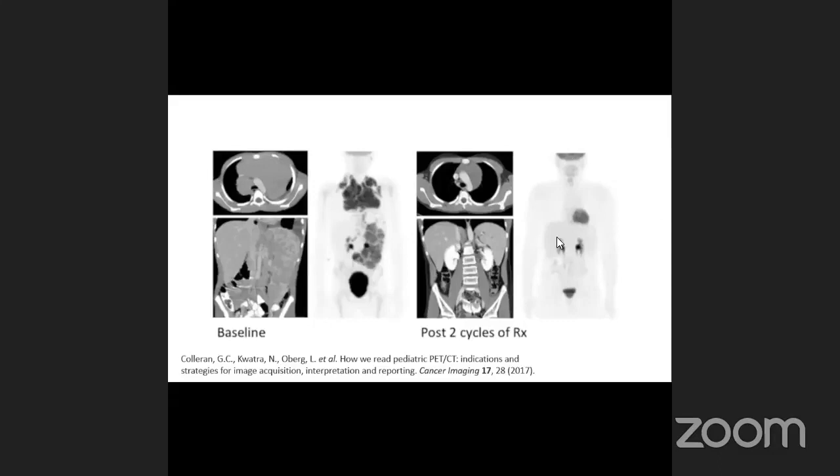So this is again one of the good things that you can see. You can note something here. If you go to the CT and you want to report CT alone, what do you report? You report that there is still partial, right? But in the PET, what do you think? There is a complete metabolic response. So you see how it will affect your management.